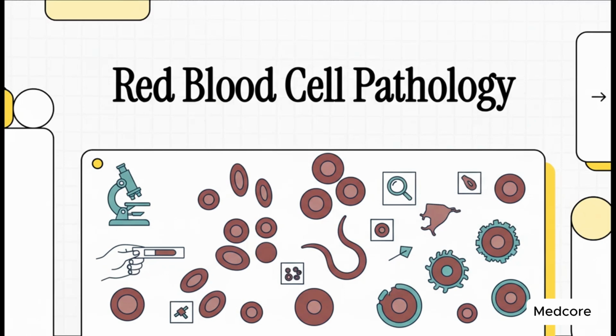All right, everyone, welcome. Today, we are putting on our detective hats and diving deep into the microscopic world of red blood cell pathology. Being able to analyze these abnormalities on a blood smear is such a core diagnostic skill, so we're going to break it all down together.